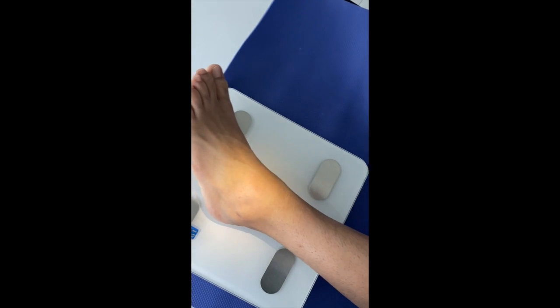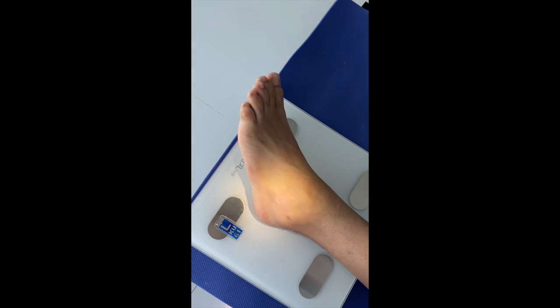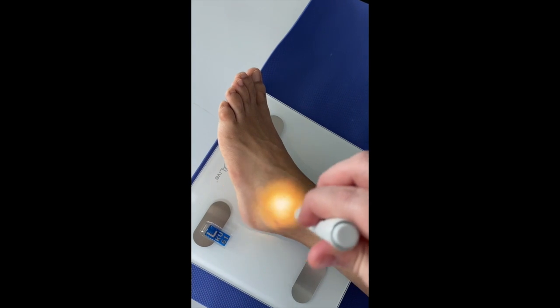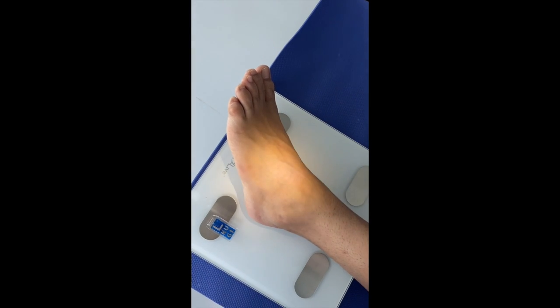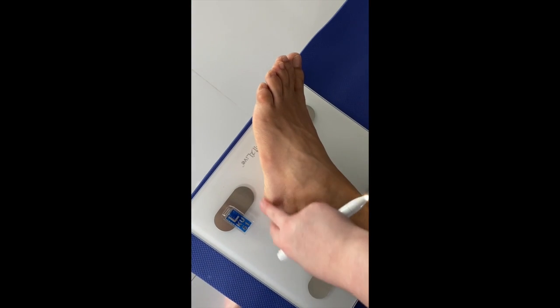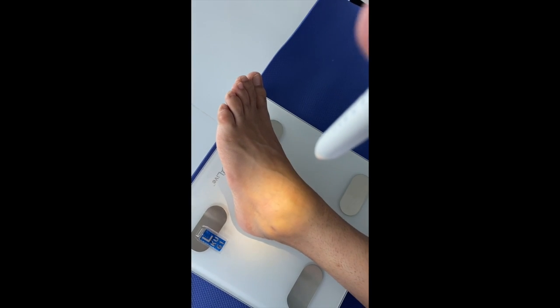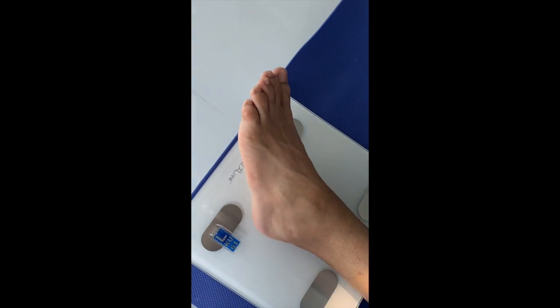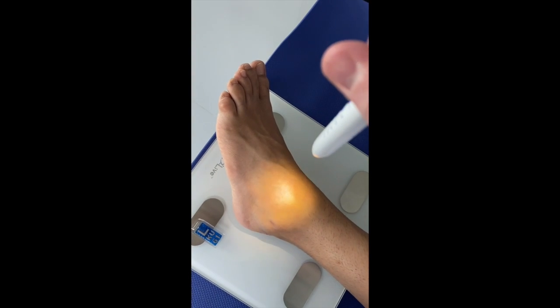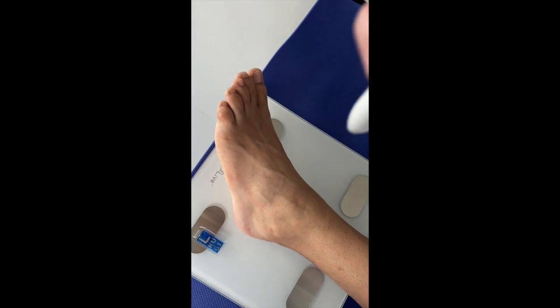For the AP oblique of the ankle, our patient is going to be supine or seated with their leg extended. You want them to rotate their leg and foot 45 degrees medially, and the CR is going to be perpendicular to midway between the malleoli. So it's going to be somewhere right around here. Perfect. You see, those are where your malleoli are. The exposure is going to be taken at 40 inches SID.